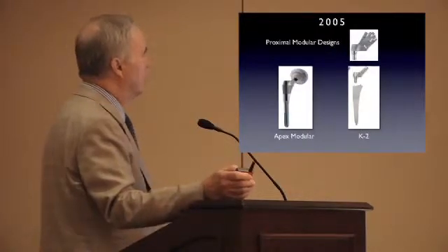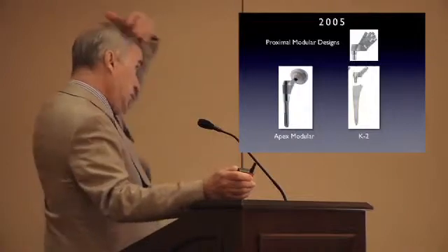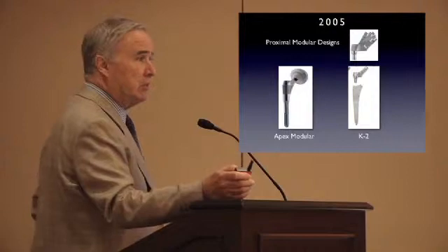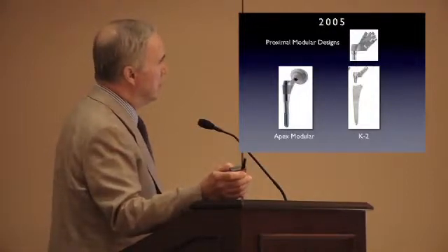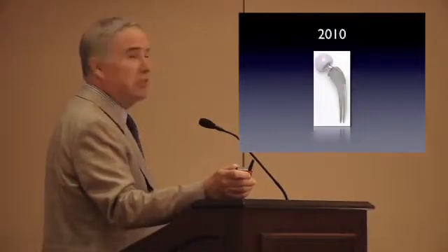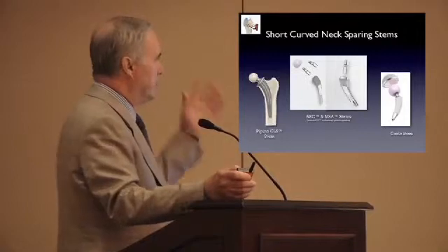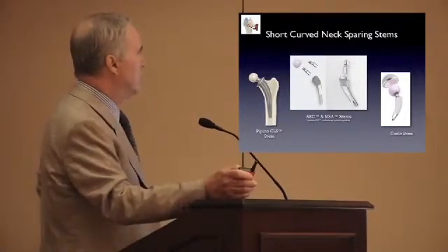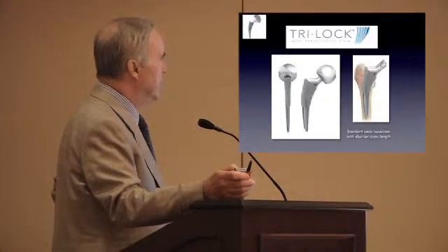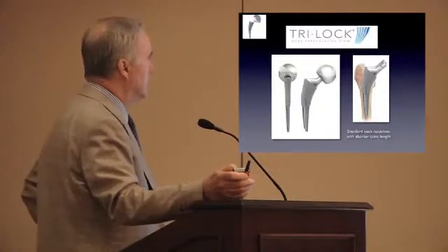And so in 2005, I started using these modular designs, the Apex Modular as a SROM type of replacement, and the K2 as a tapered stem type of replacement in my type C bone. And this year in March, I started doing the ARC stem. This is a repeat slide. It's a curved neck sparing stem, as opposed to one that's sort of a taper fit stem.